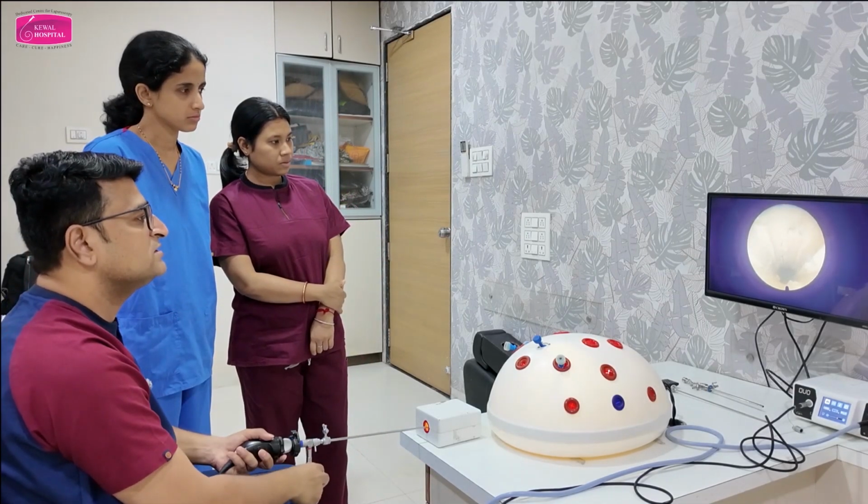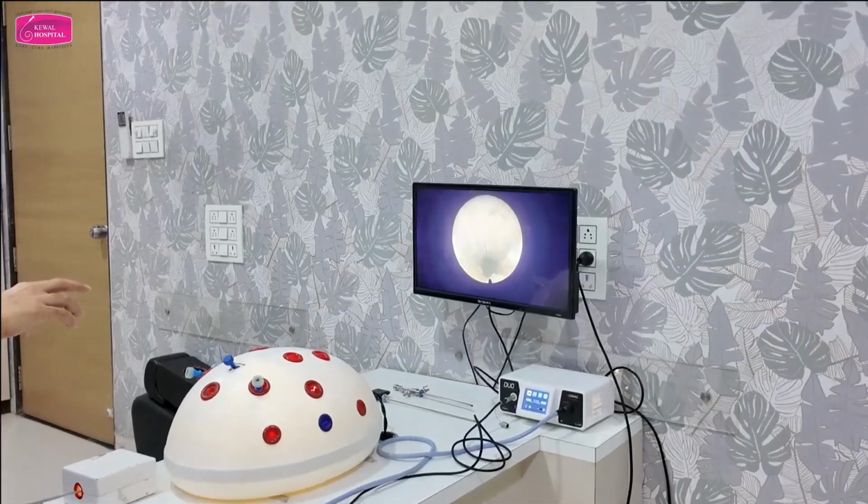TV चालू आहे ना. First एकदम zoom in करून घे चांगला, TV कडे घे.